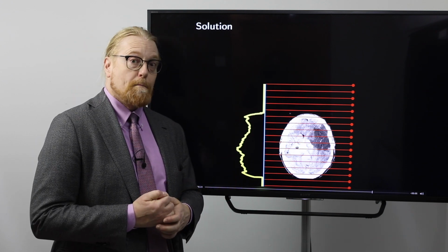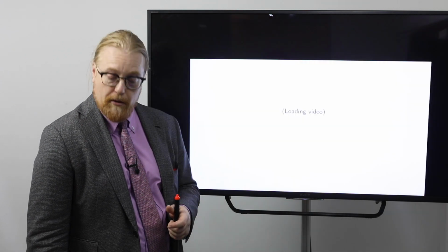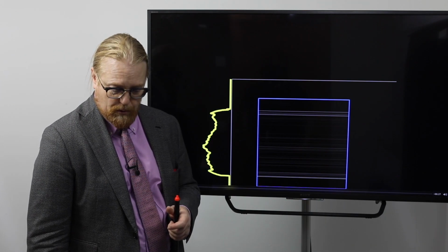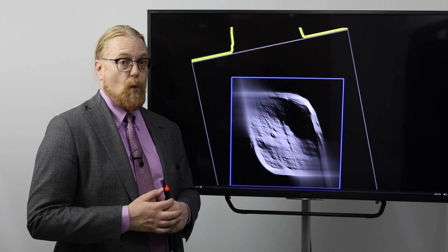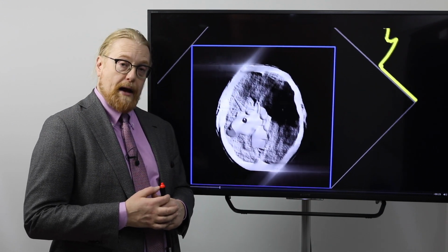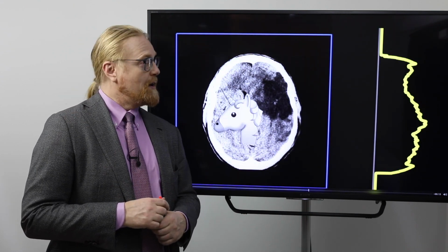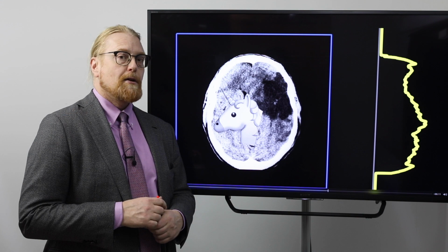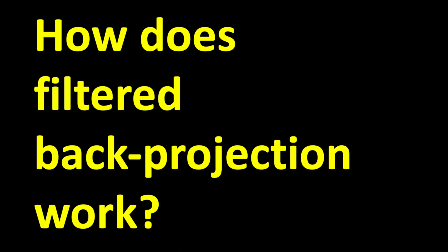The machine has to compute what is there. So we need some method that takes as input the measurement, uses it in some way, and calculates back whatever there is. And next I will explain to you how the most popular reconstruction method works.